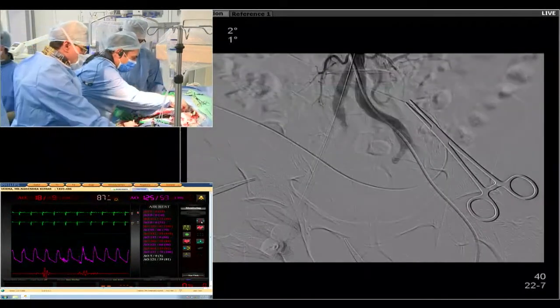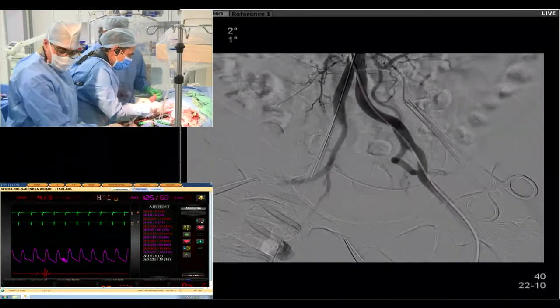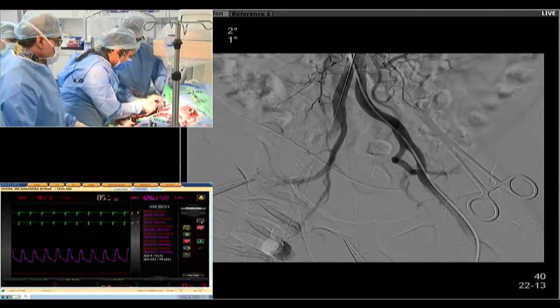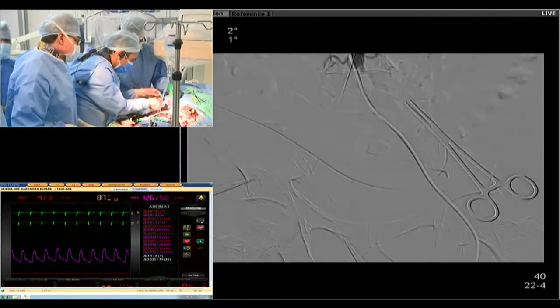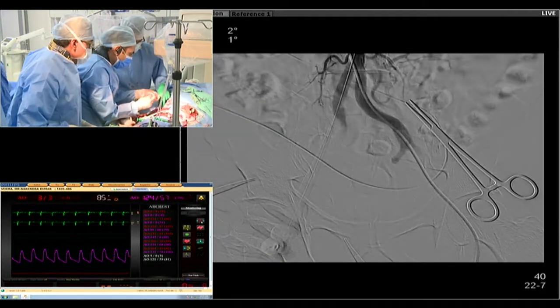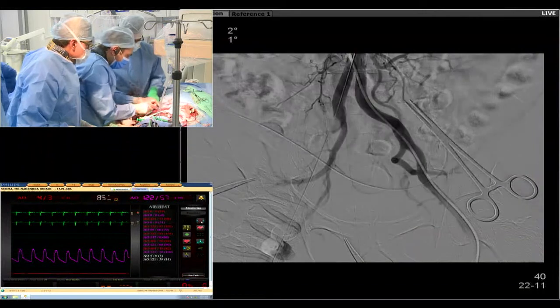So we have three ProGlides. We'll pull all the blues together first, and then just fix the white one. This is white. Again, you don't pull the white thread, you pull the blue thread, because if you pull the white thread, the knot gets locked.